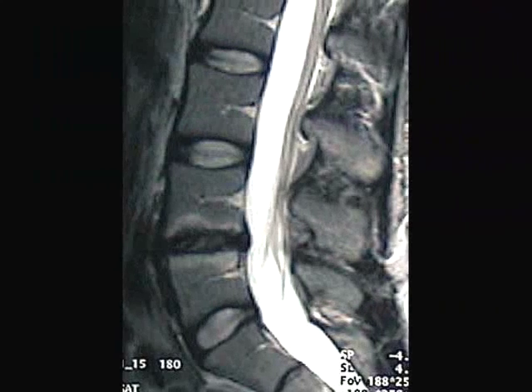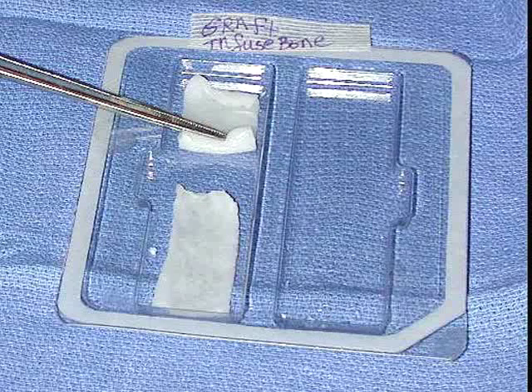This is an MRI scan demonstrating a very degenerative disc with what are called Modic changes in the bone at the L4-5 level. This is a classic case of a patient that should do well from a lumbar interbody fusion procedure. This is an example of what's called Infuse, which is bone morphogenic protein. It's put on this sponge material in a liquid form, and the sponge material acts as a carrier for the Infuse product to be put into the fusion device.